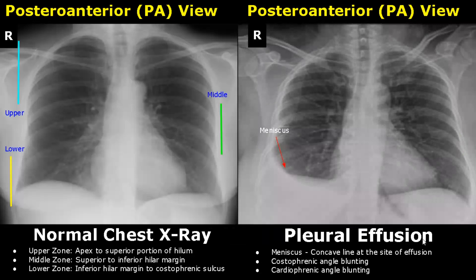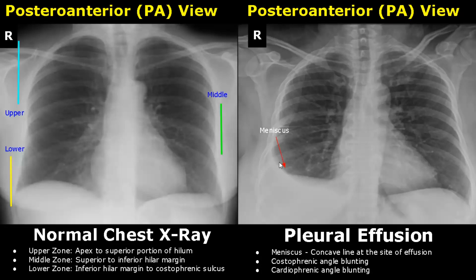Pleural effusion refers to accumulation of fluid in the pleural cavity due to various conditions. It leads to formation of a meniscus, which is a concave line at the site of effusion. You will see this concave shaped interface between the lung field and the pleural effusion. The right costophrenic and cardiophrenic angles are blunt.